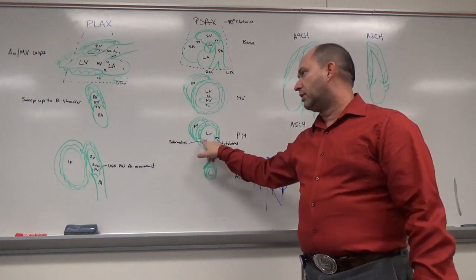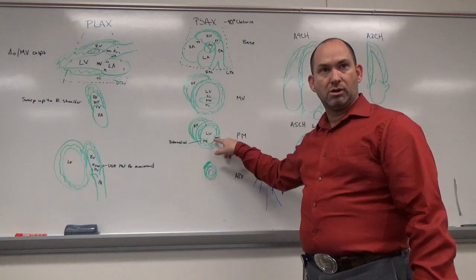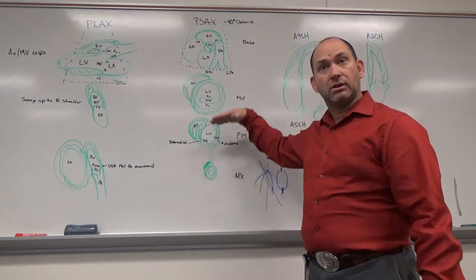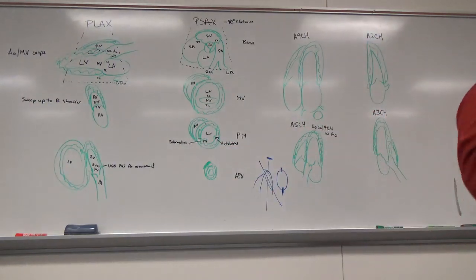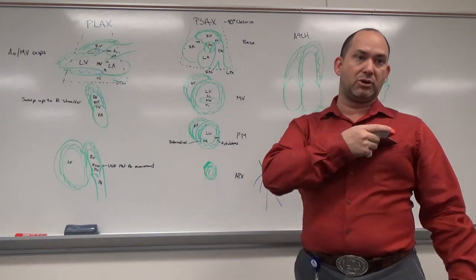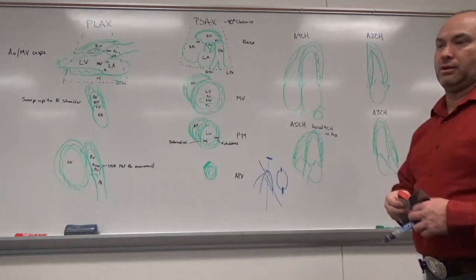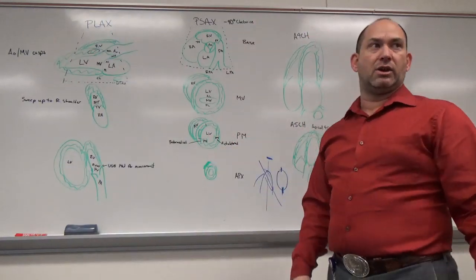This is actually on the inferoseptal wall. This is the anterolateral wall. So anatomically speaking, this one is actually higher than this one, towards the chest wall. But it's how we interface it. Are we exactly in the center of the chest or on the center of the heart? No, we're actually a little bit over to the left, and the way we're angling it, that's just how we tend to see it. But if I drew this image and twisted it around, how can you tell what's what?